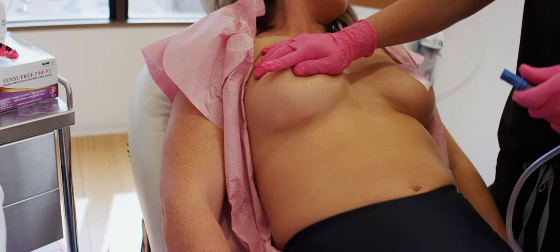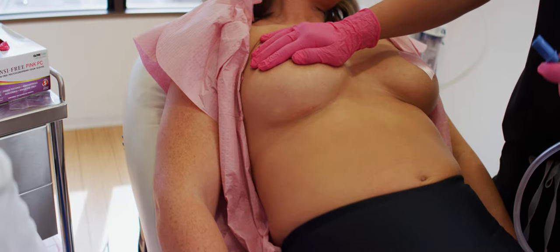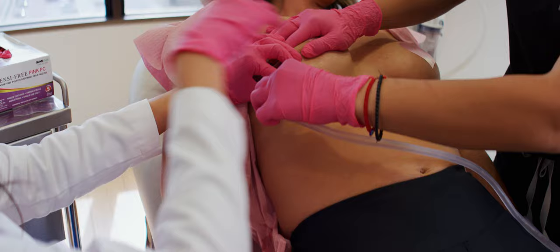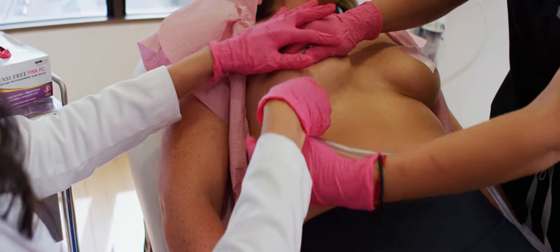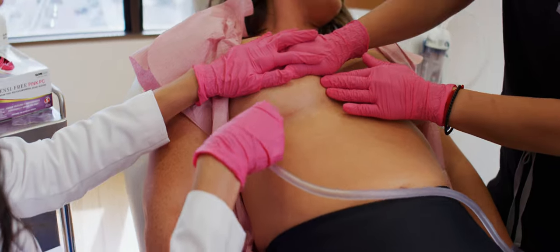That little area is all numbed up and now we are going to use just this tiny little catheter right here. Super easy. And there's that clear, beautiful saline fluid coming out of it, and we're just applying some very gentle, nice pressure.